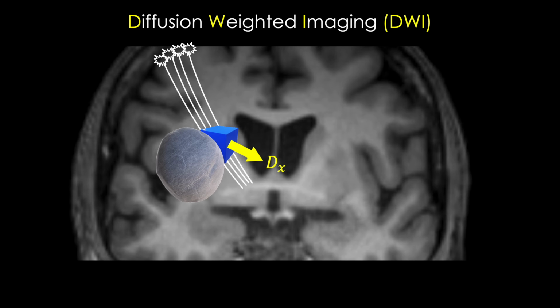So you can see there's a problem here. We're limited to only the directions we applied our diffusion gradients along, and while in this case the diffusion coefficient with the greatest value is along the x direction, it does not mean this is the true direction the white matter tract is running. This is the true direction, shown here in blue, and what we need to find in order to accurately model these tracts for surgery or other purposes. So we've come to a major problem.